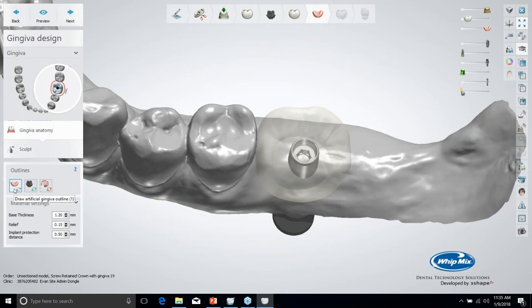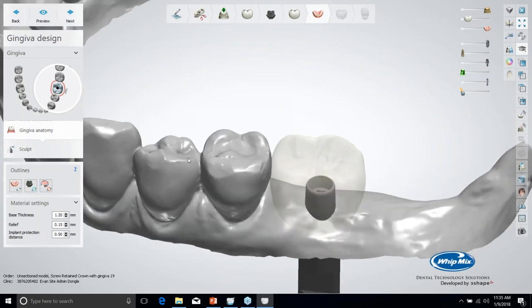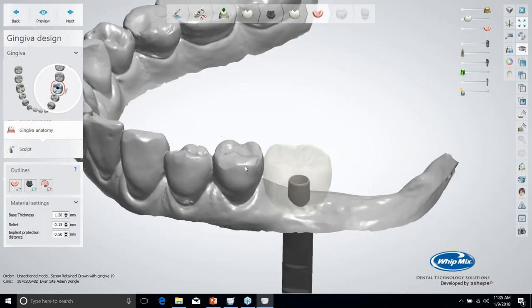So the first button lets us draw the outline for our artificial tissue. The second one allows you to put a window around each of your implants so that it doesn't bridge the tissue across the implant. It protects it and makes sure that it leaves a hole there. And then the third one is the relief zone. If you want to add relief wax, for instance, if they had some deep tissue fissures you didn't want it building the anatomy down in there, then you can add relief wax.